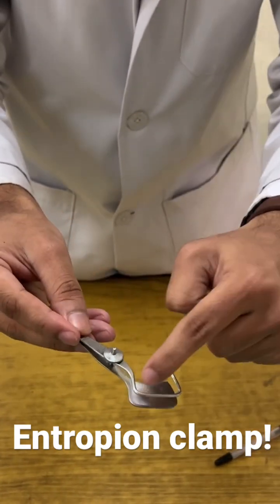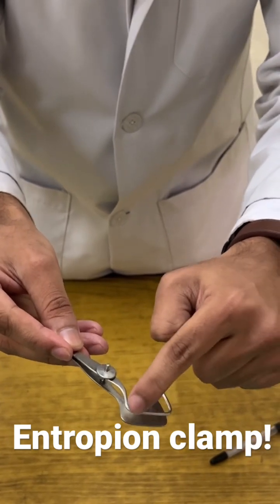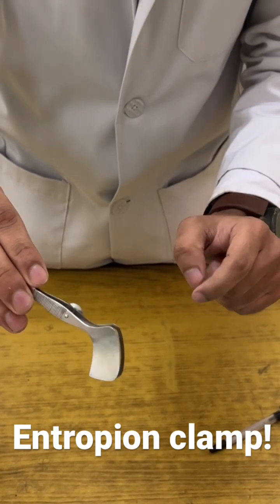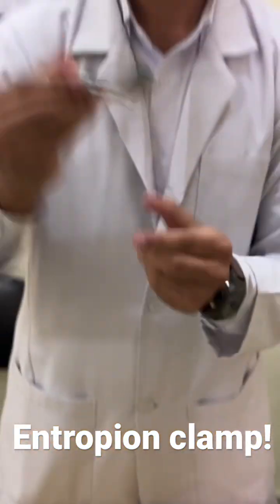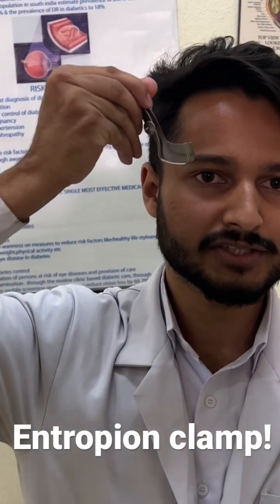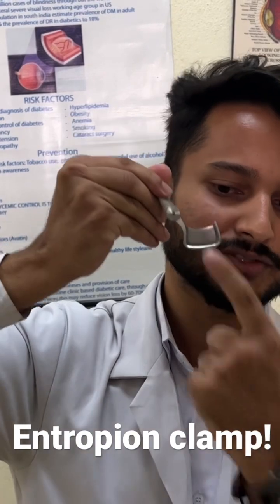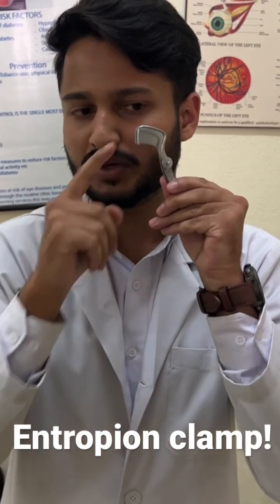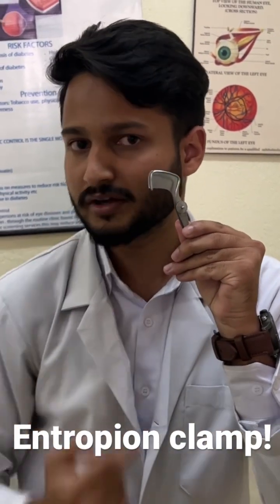You should make sure that the U-shaped rim side is facing towards the skin and the plate is facing towards the conjunctiva. As demonstrated here, the D-shaped plate will be under the conjunctiva and the U-shaped rim will be at the skin side. The handle should be held temporarily.